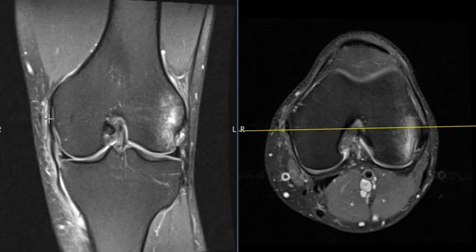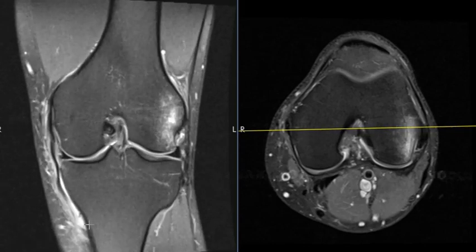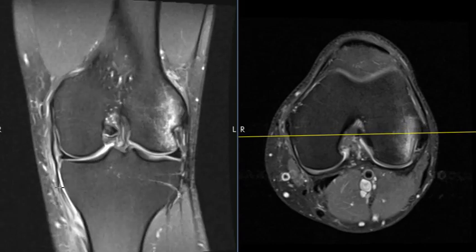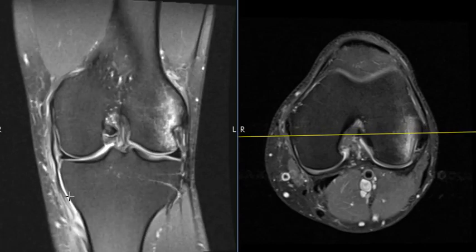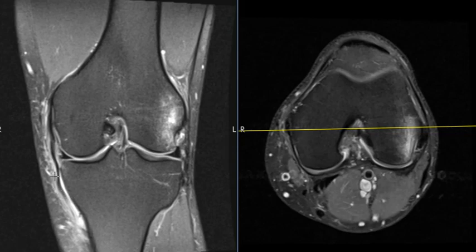This is what we call a menisco-capsular junction tear and separation, and this is related to an injury of the medial collateral ligament. The MCL comes off the femur up high — that looks good up here — but comes down here looking a little lax and wavy; it should be very straight and taut. The problem is down here where we see it just fizzle out. We don't see the tibial attachment very well, so this is a partial tear — high-grade partial tear, maybe even a complete tear — from the tibial attachment, and it's recoiled back a little bit.